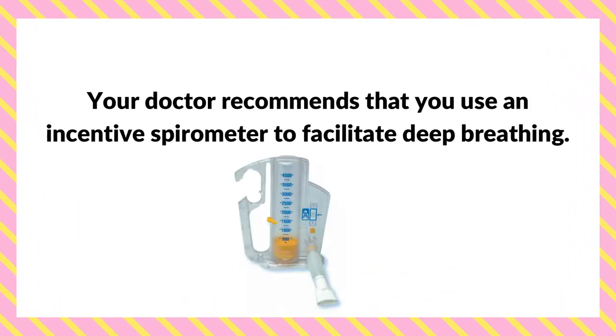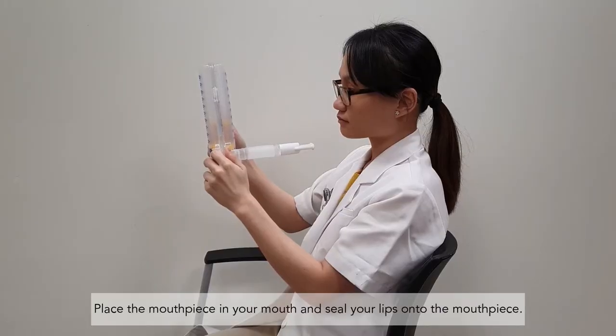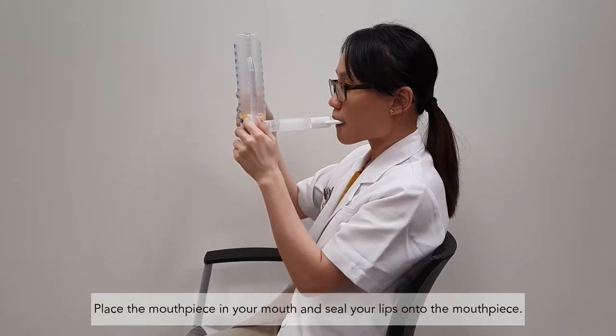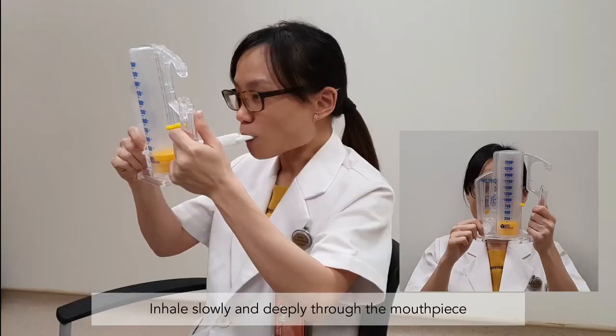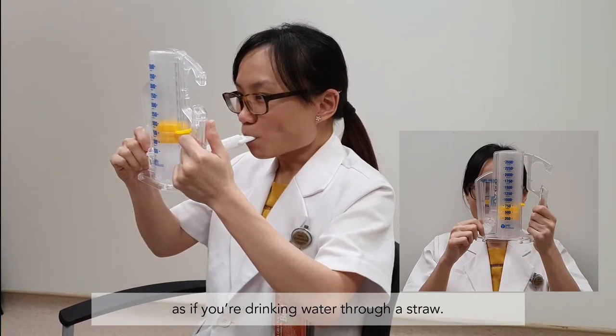Your doctor recommends that you use an incentive spirometer to facilitate deep breathing. Place the mouthpiece in your mouth and seal your lips onto the mouthpiece. Inhale slowly and deeply through the mouthpiece as if you're drinking water through a straw.